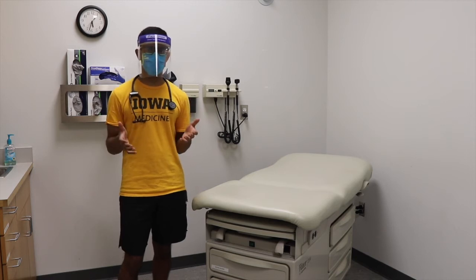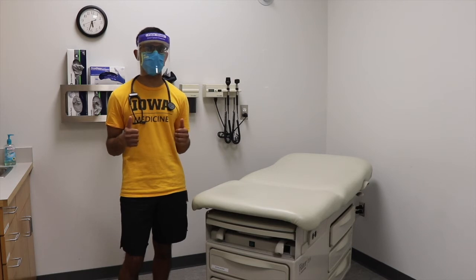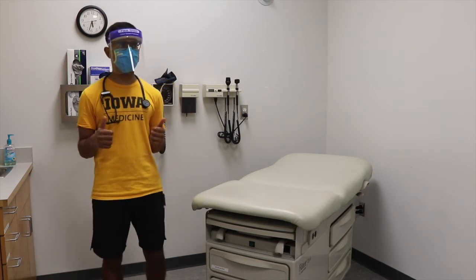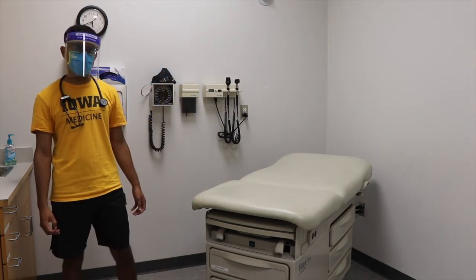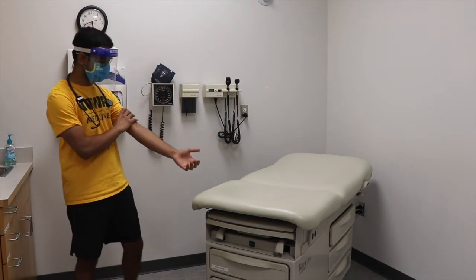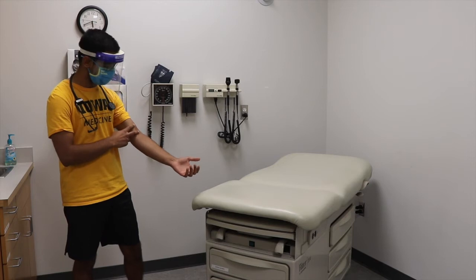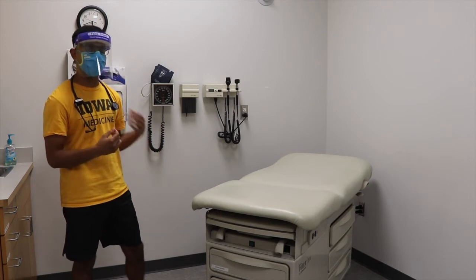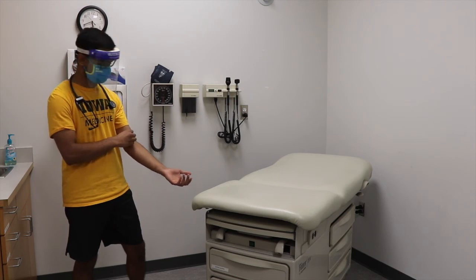Now, blood pressure fluctuating throughout the day with exercise is normal, but if your blood pressure is consistently high for a long period of time, that can cause damage to your vessels. Some of the instruments we use to measure blood pressure is the blood pressure cuff right here. This goes on the patient's arm, and it's placed about an inch above the inner elbow. And then next we use a stethoscope to listen for the brachial pulse in this region.